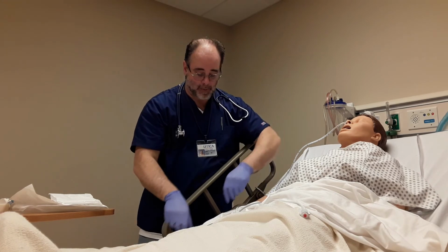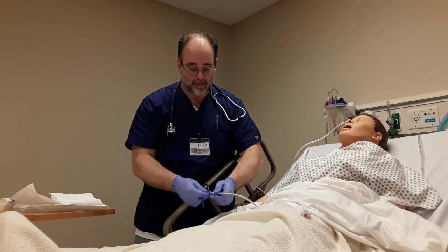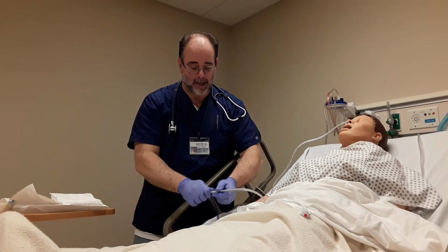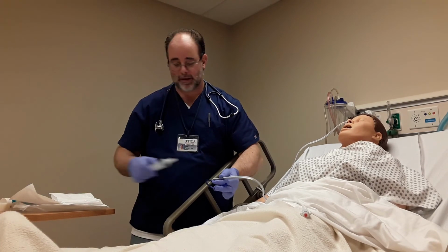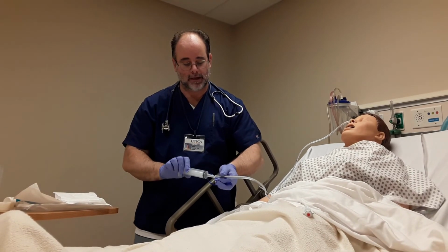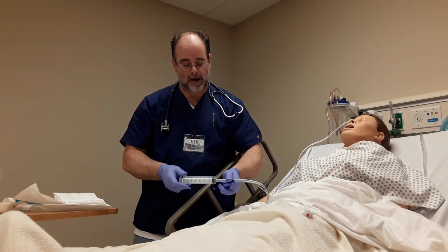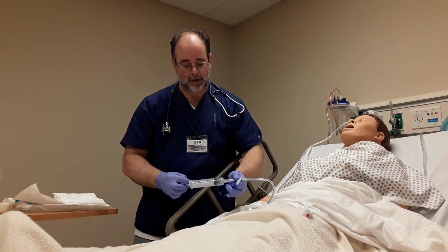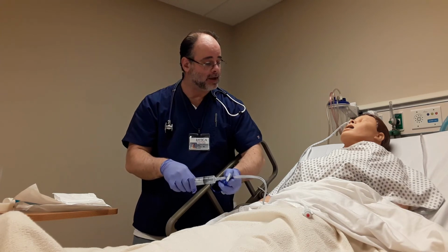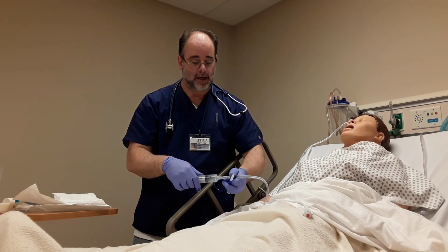So now that we have that in place, I can take off my connection piece temporarily and then place the syringe to the end and extract some gastric contents. And the instruction for students would be 10 to 20, and I see coming out some green bilious type drainage.